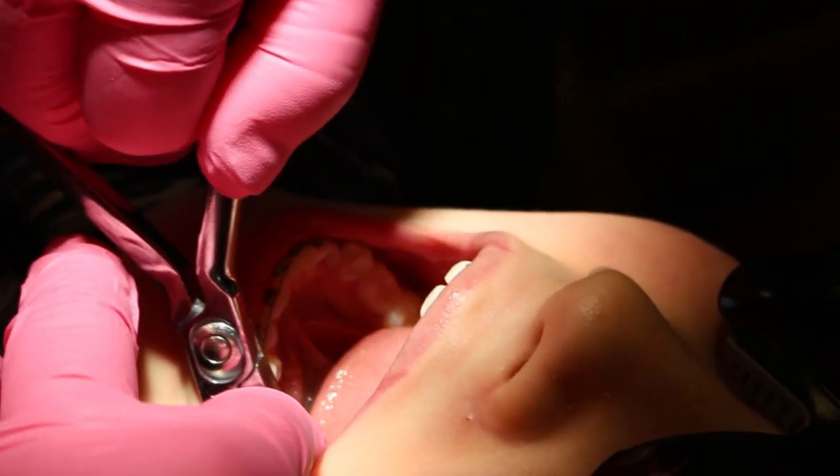We use a nitinol wire, which is a really flexible wire to start, because we want to be really gentle on the teeth — kind of say, hey, we're getting ready to move, but we're going to give it a really gentle force to start.